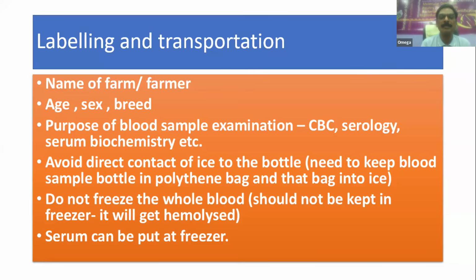Generally, if the samples have to be sent the next day, many people collect the samples and keep them in the deep freezer. Because of that, the samples get hemolyzed and are of no use. No test can be done, no hemoprotozoa, no serum, nothing can be done with the samples that have been frozen. I am talking about whole blood. Whole blood should not be frozen.